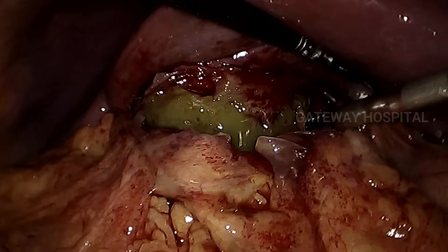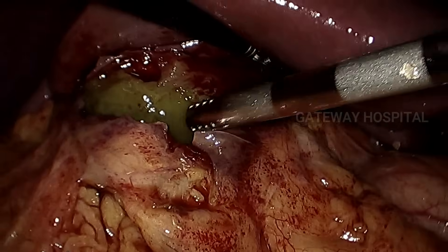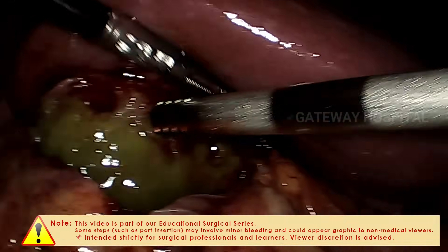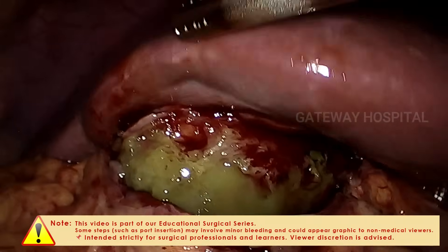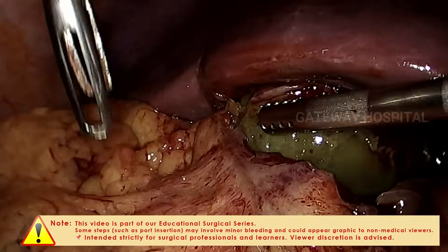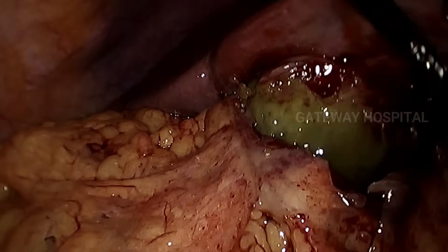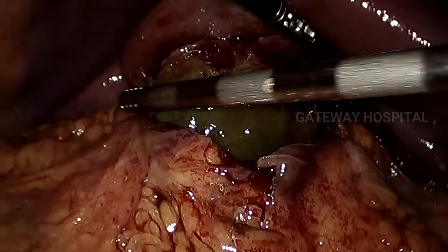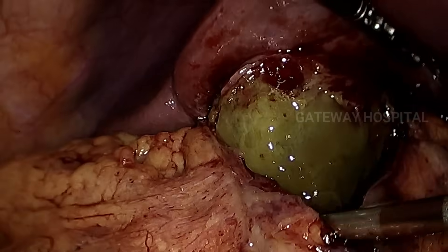At some place you should be able to identify the gallbladder wall without any doubt, and once you are happy with the anatomy of the gallbladder wall, you can proceed on the gallbladder wall without deviating from the wall itself.